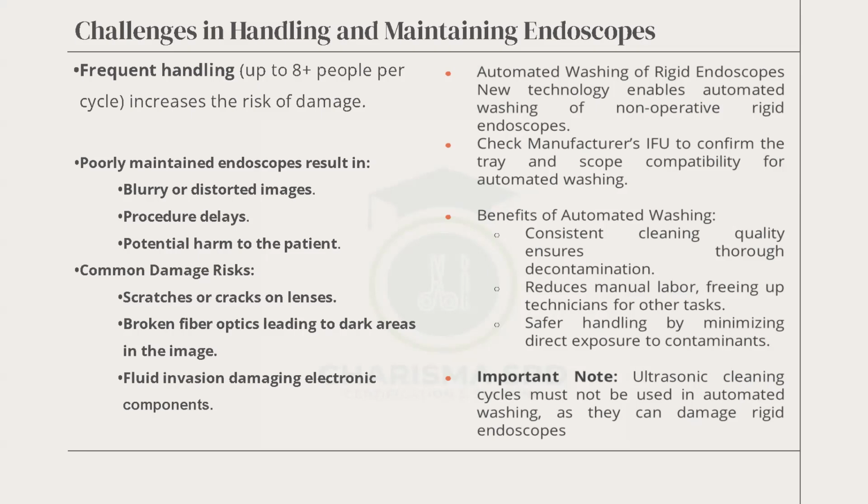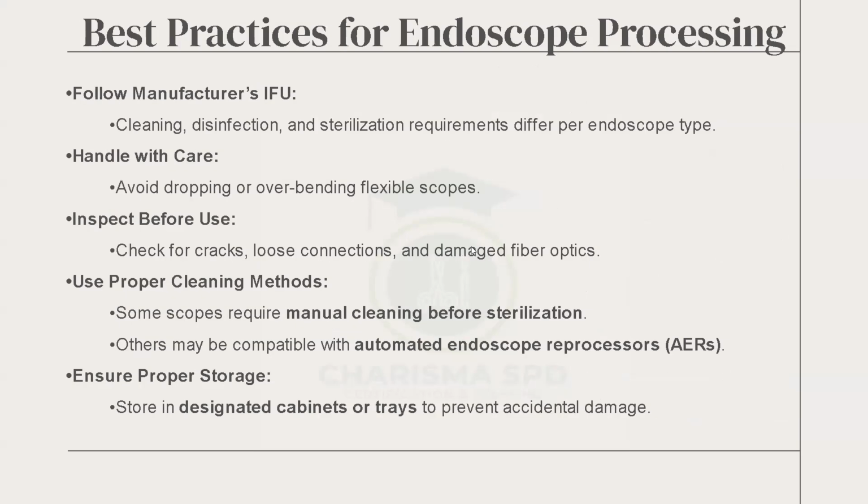It can damage the fiber or the lens of the scope. Ultrasonic machines use a process called cavitation to do the cleaning, and that can damage the lens of the scope. It creates bubbles and that can destroy it in the process. Next slide.